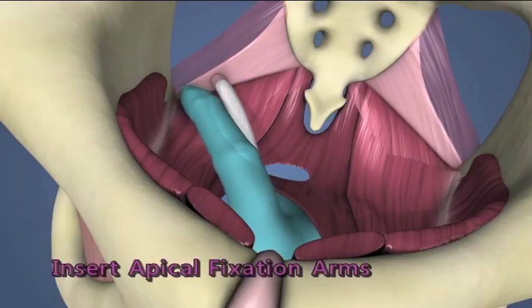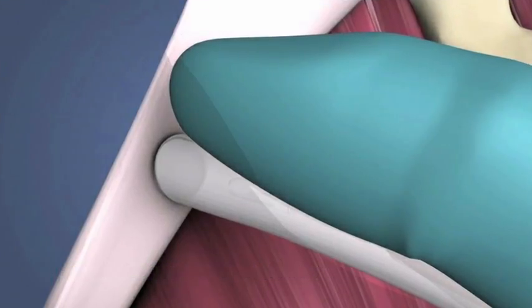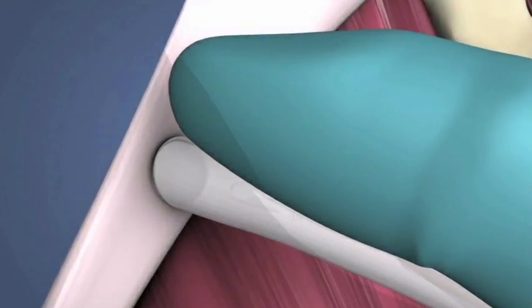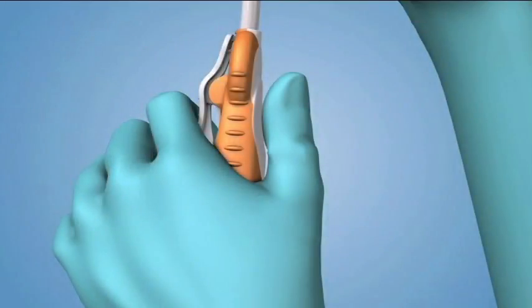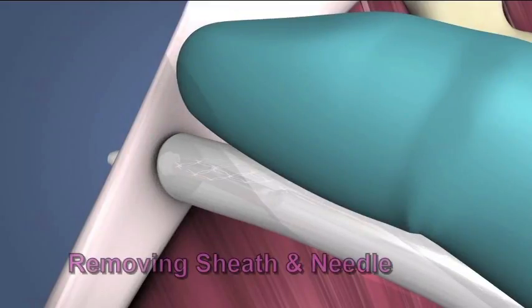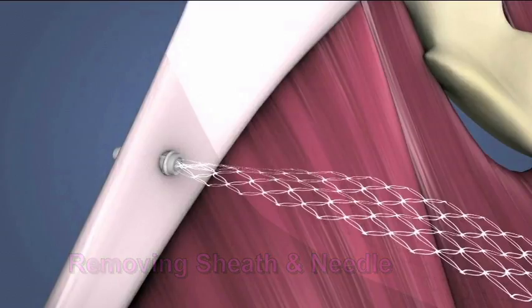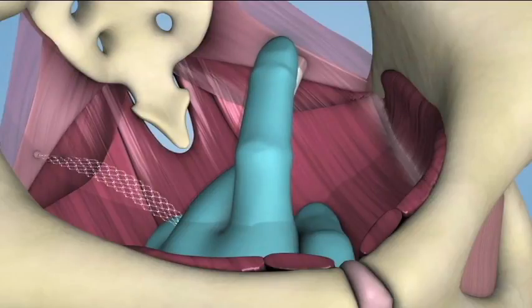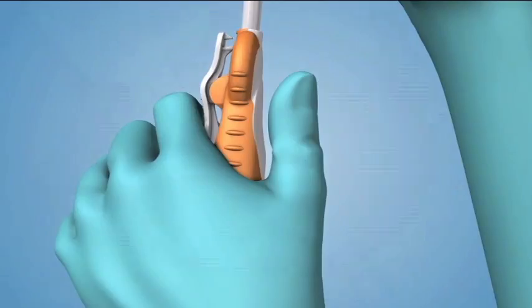Inserting the Apical Fixation Arms. Place the tip of the sheath at the base of the palpating finger such that it is perpendicular and on the caudal side of the sacrospinous ligament 2 cm from the ischial spine. With your index finger, press and hold the release mechanism on the handle and drive the needle and fixation tip into the ligament. Remove the needle and sheath by pulling back gently on the needle until it disengages from the tip. Pull gently on the fixation arm to ensure it is securely fixed in the ligament. Repeat these steps for placement of the fixation arm in the contralateral side.